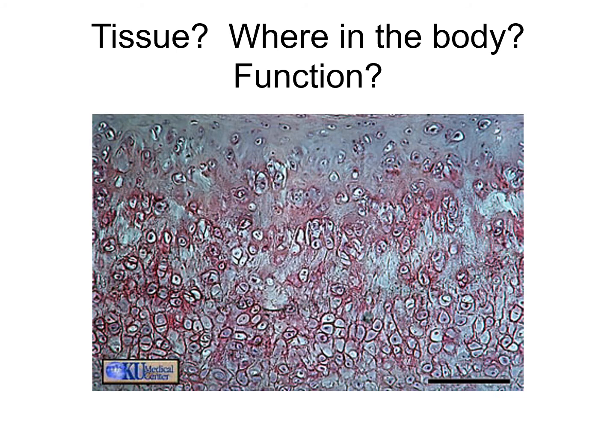Question. All right. It looks like chondrocytes. Those are chondrocytes. What kind of cartilage, since you said chondrocytes, it must be cartilage. So elastic. It is elastic cartilage. Specifically, what kind of tissue is cartilage? Connective?